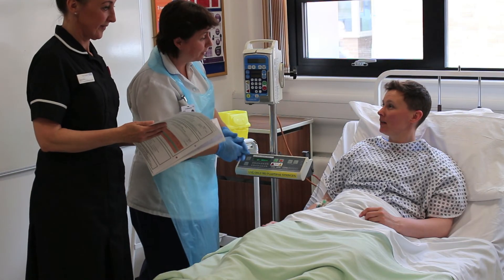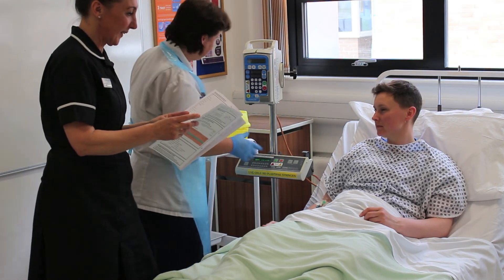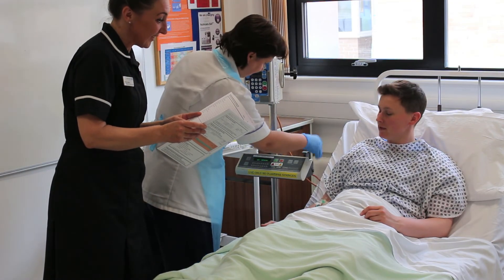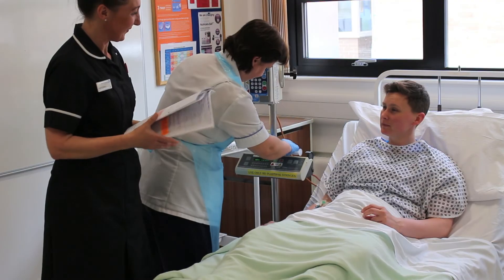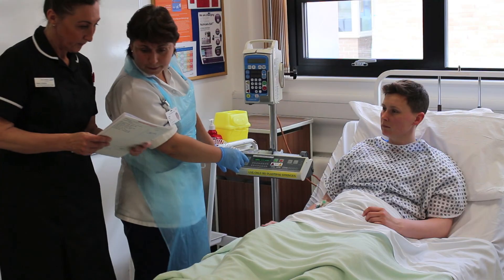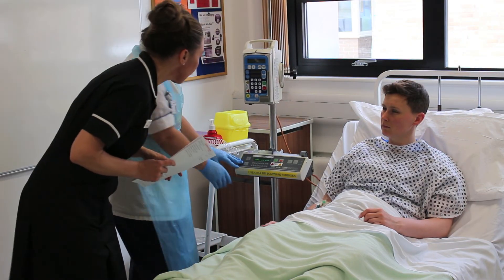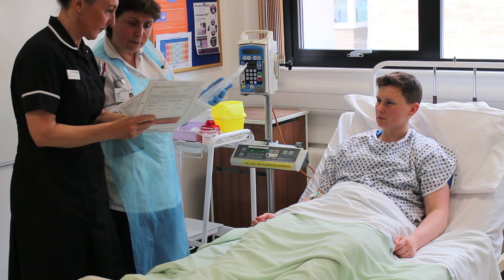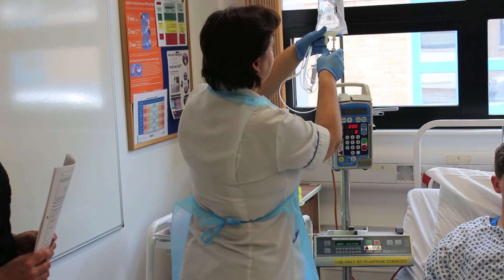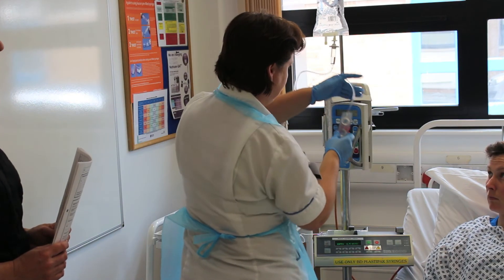At the patient's bedside you should both confirm the patient's identity and that they are happy to proceed. Attach your 50 ml insulin infusion into the syringe driver and once in place purge the line whilst keeping the other end in your clean tray. Set the rate as prescribed on the insulin chart and ensure your second checker confirms this. Now check the fluids that have been prescribed on the medicines chart, attach the IV administration set and keeping the end in your clean tray set this to run through your infusion pump.